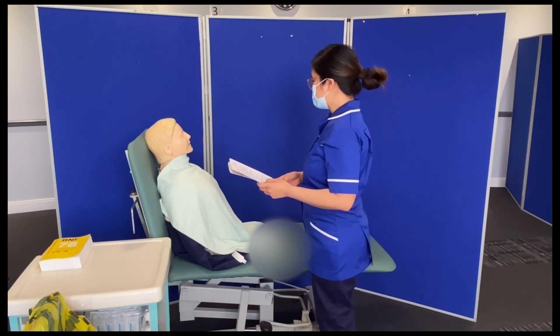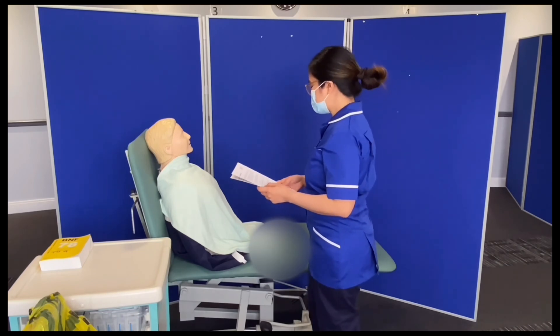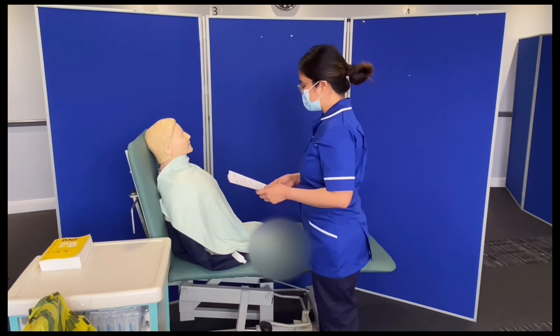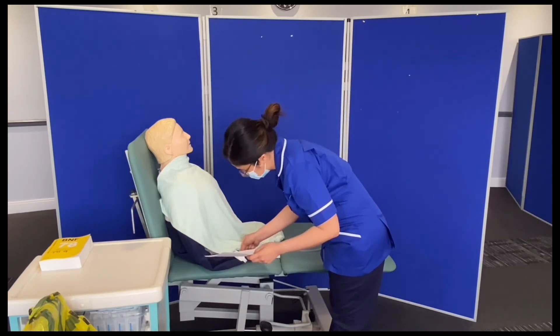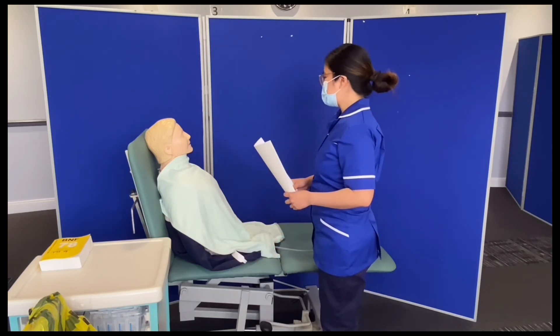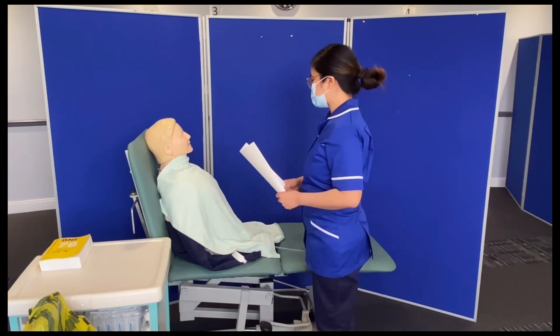Of course, that's okay with me. But before anything else, I need to confirm your date of birth and your name as I verify your ID band. My full name is Jennifer Garnett. My birthday is 22/08/1969. And your MRN number is 1234567X. Can I also ask if you've got any allergies? No, I don't have any allergies.